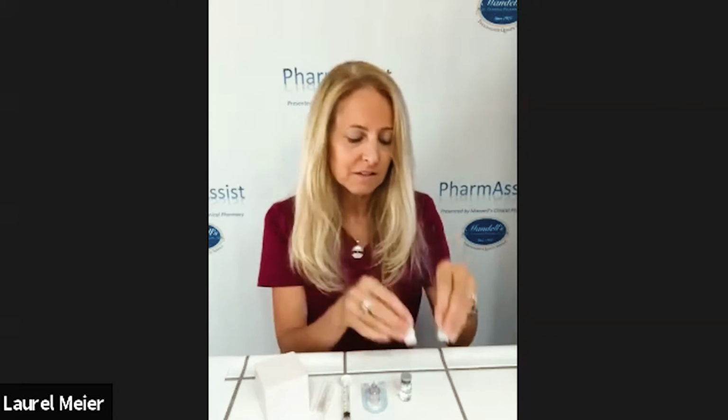Menopur comes in little powders, and we're going to use our imagination and pretend that there are little white discs of powder in these vials. You'll also need a container of saline, a Q-cap, which is a needleless mixing device, a 3 ml syringe, and a small needle for giving. So make sure you have all your supplies ready. And the first thing you're going to do is take the caps off of your supplies.